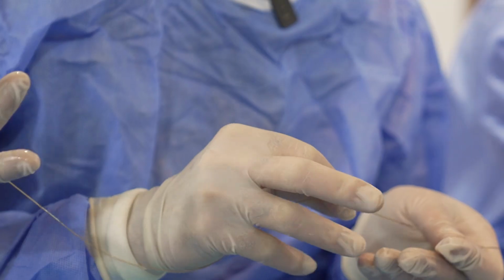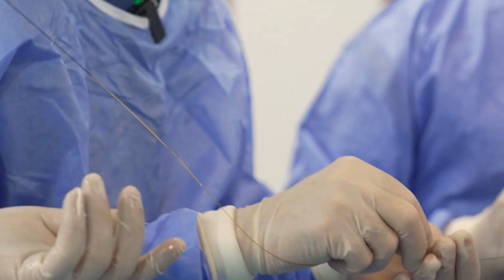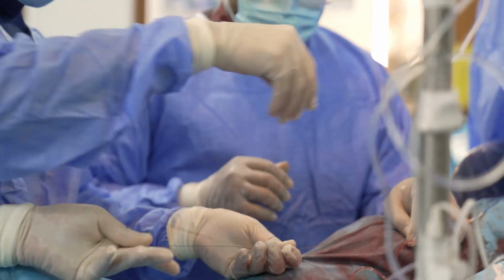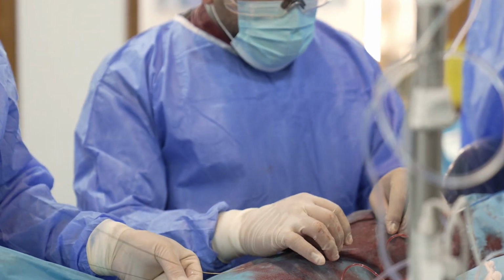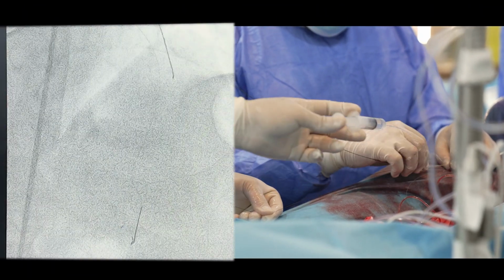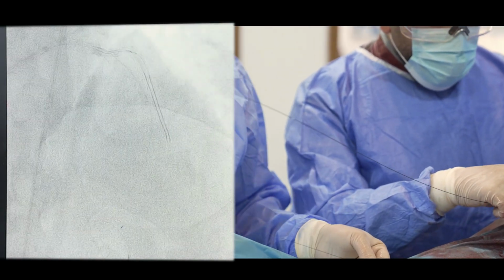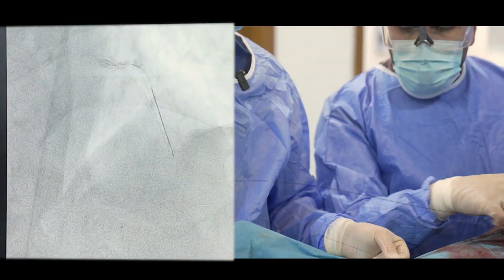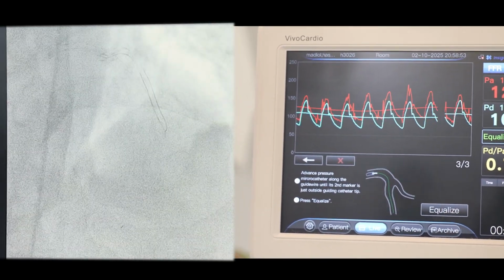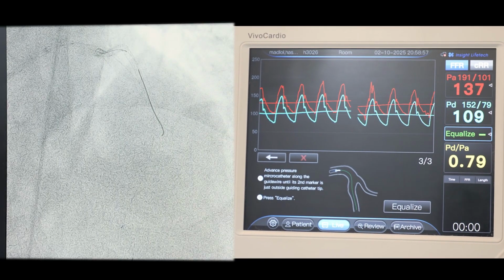The transducer is at the tip. We can keep our wire inside and go in and out whatever time you need. Okay, go. Open the 2E. So we have two dots, 3 millimeter apart.